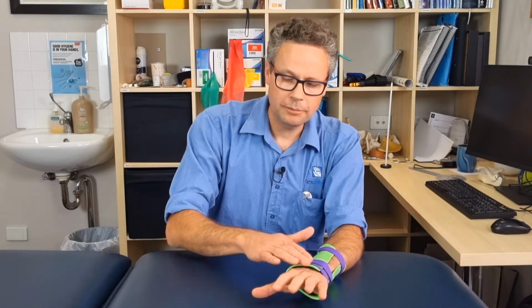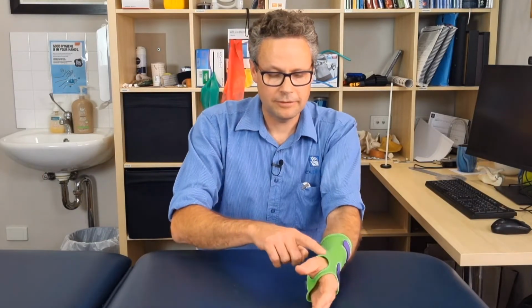A second concern might be tingling or numbness developing in fingertips or thumb, and that would usually indicate that maybe the splint is pressing or irritating a nerve somewhere. And once again, the splint should be adjusted.